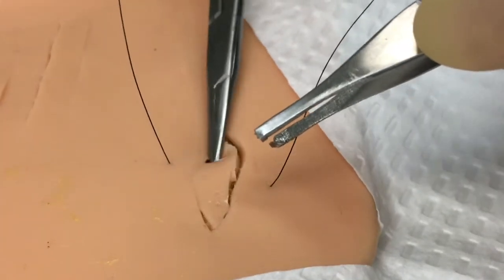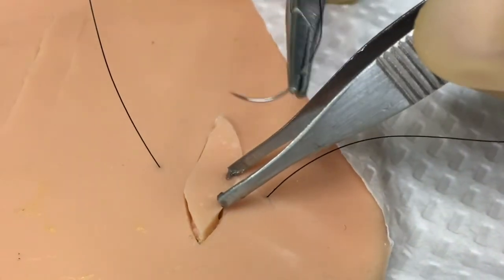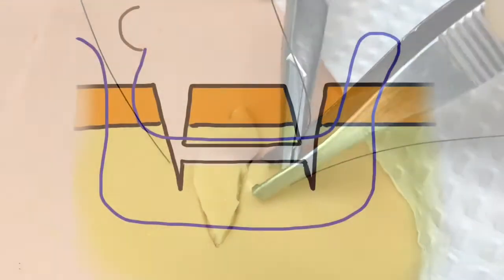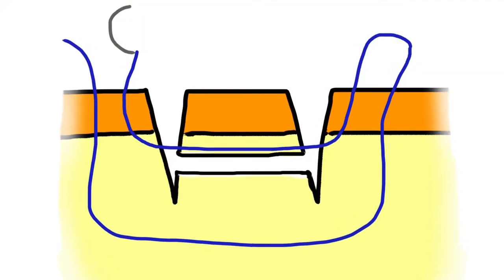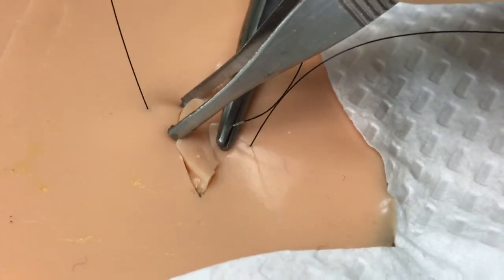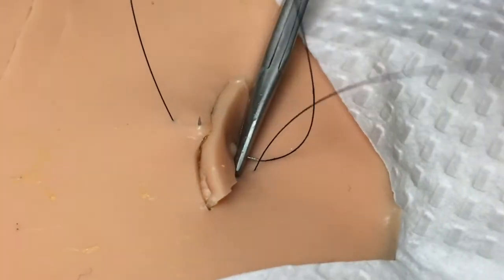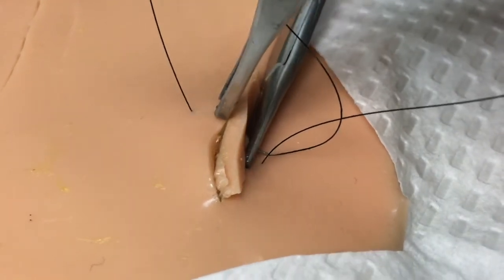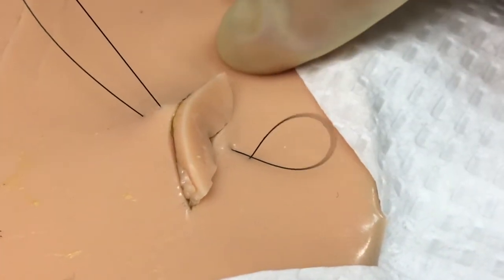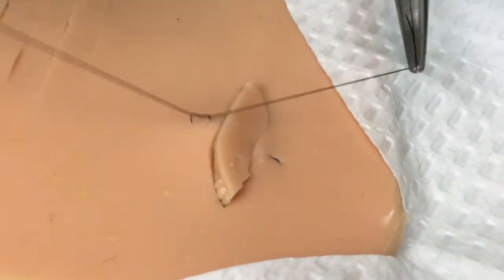The next step would involve backhanding the suture and placing it again in a near-near fashion, starting on the same side of the wound where you just exited, running through the dermal portion of that evulsed tissue island, and then exiting again on the far side of the wound — the same side where the suture was initially placed. The suture is then tied off on this side of the wound bed, effectively creating a vertical mattress pattern to distribute tension throughout the wound, as well as approximate that evulsed piece of tissue back within the wound bed.